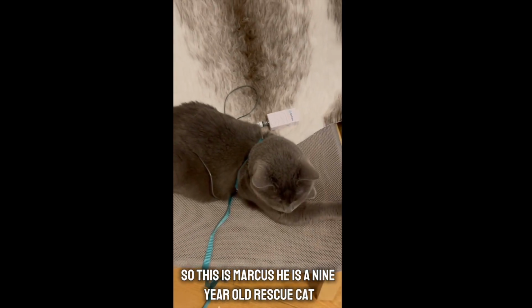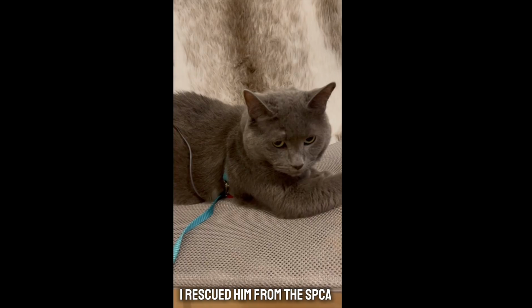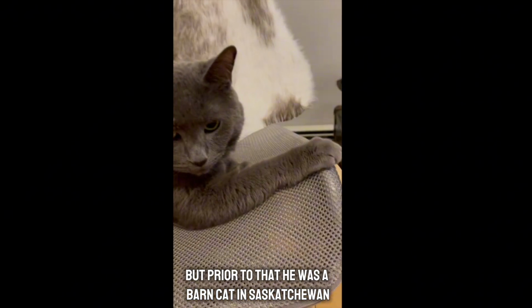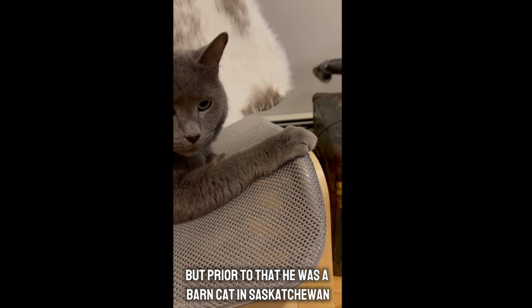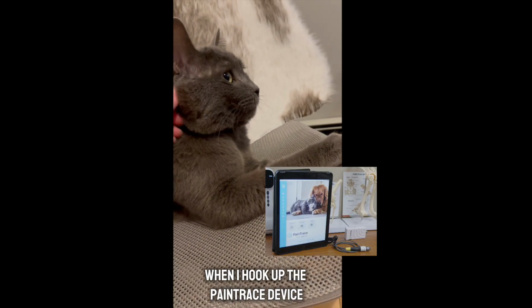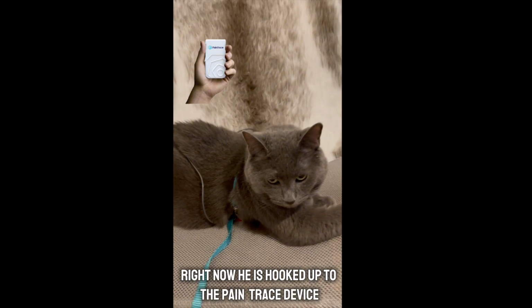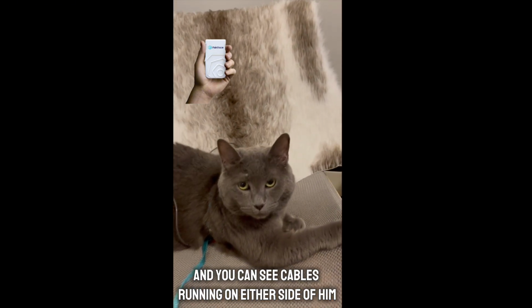So this is Marcus. He is a 9-year-old rescue cat. I rescued him from the SPCA, but prior to that, he was a barn cat in Saskatchewan. So I am expecting to see a little bit of pain when I hook up the PainTrace device, just because of his past life.